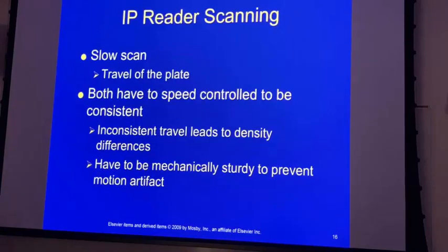Once in a while you run across an X-ray image where you've got these squiggly lines. You've got a nice, fine, bony cortex, and all of a sudden it just kind of goes, it's like it's got a P wave running through it. And that's exactly what happened: for whatever reason there was some vibration during either the fast scan or the slow scan.